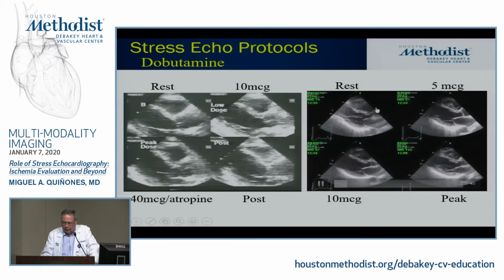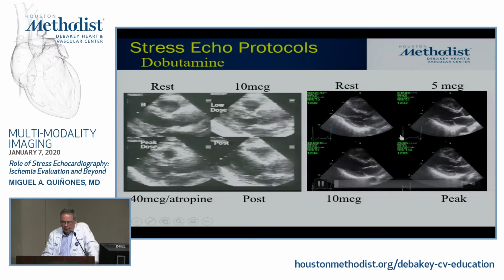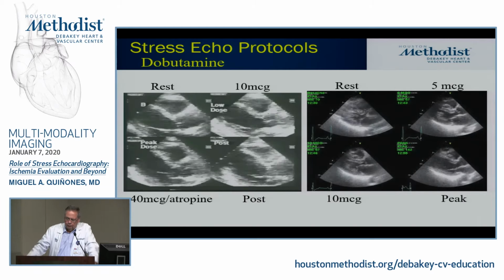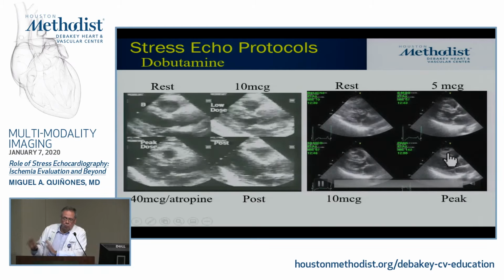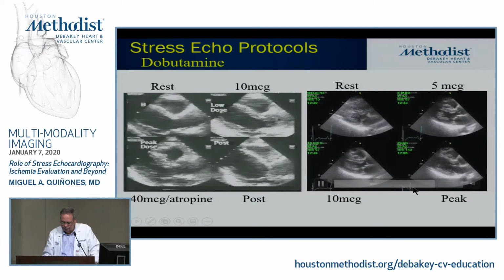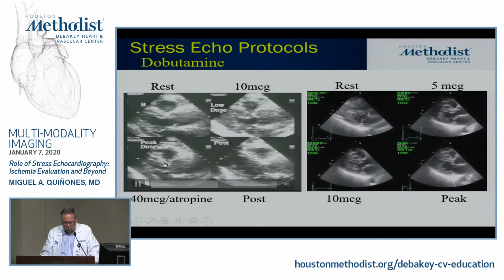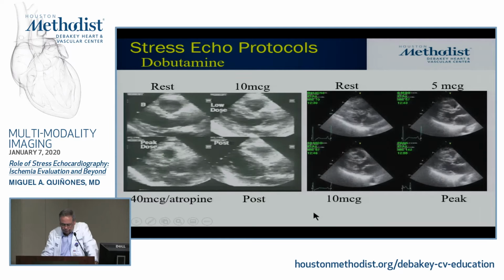The reason being that since we do a lot of viability, this protocol is a little nicer to look for subtle changes and improvement in contractile reserve. So we do not put a post. We do look at post later, but the post is not placed in your traditional quad. But there's nothing wrong with this approach also. This is done in many labs. They do a low dose, a high dose, and a post.